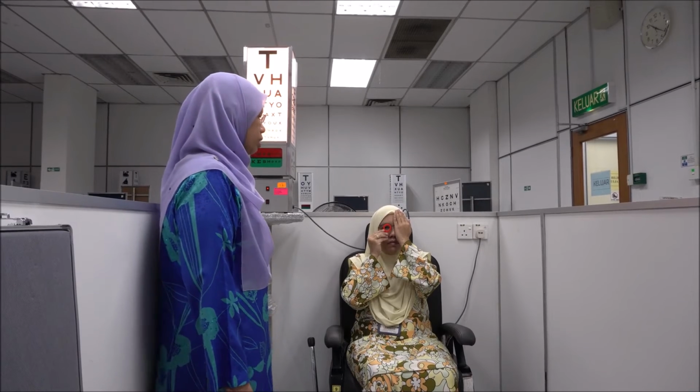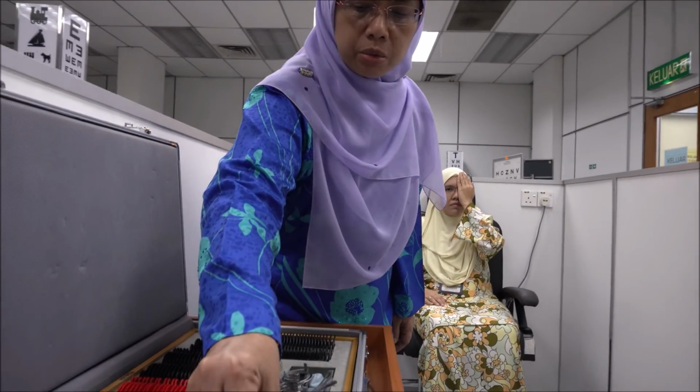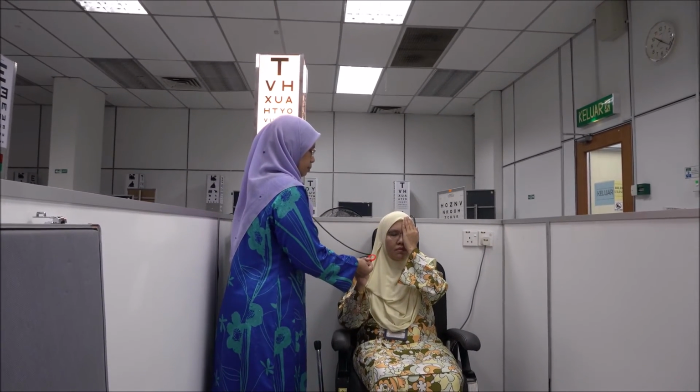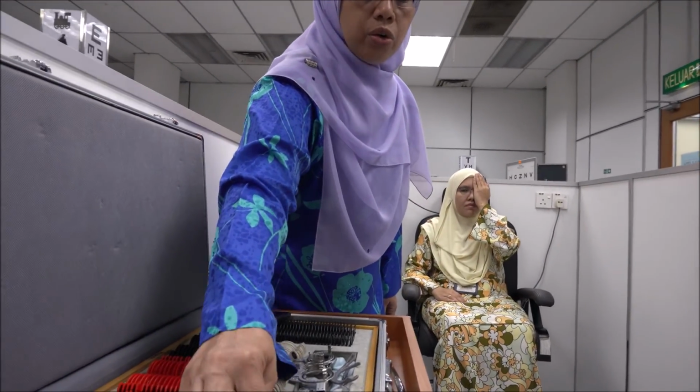Once you've recorded the visual acuity, you remove the lens and start taking the next power, which is ±2, and repeat the whole procedure again. So you only take visual acuity of one eye for both minus and plus sphere lenses.